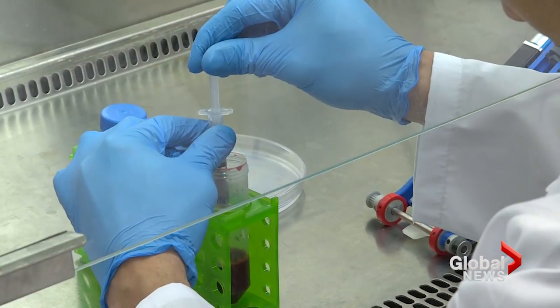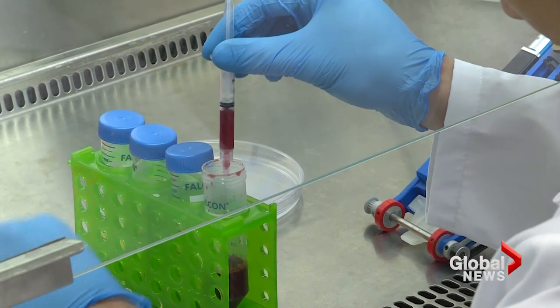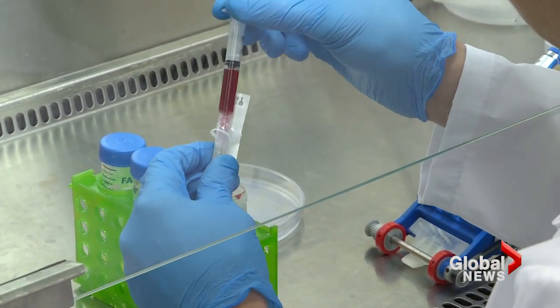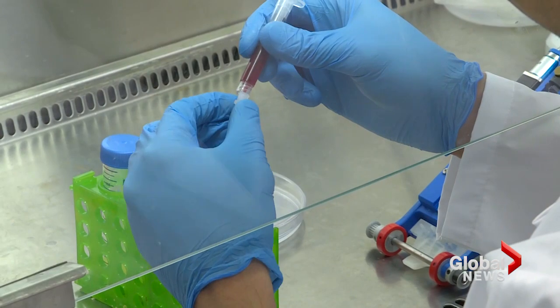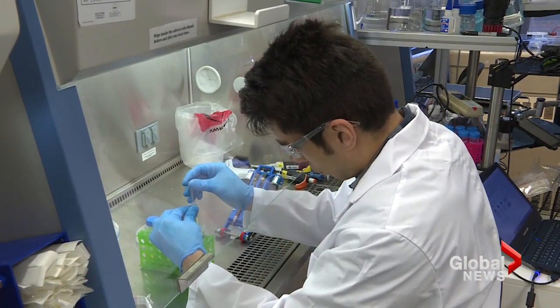It deposits a planar layer of tissues — either in a laboratory setting into a dish, or directly onto a wound bed. It deposits a layer of a biomaterial, a squishy gel that contains biological cells — skin cells — in a layered organization that mimics very much the organization in human skin.